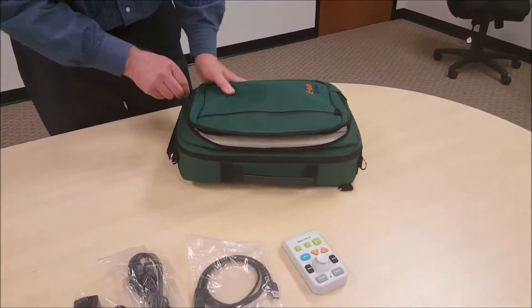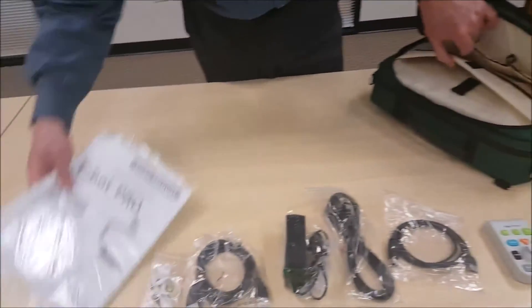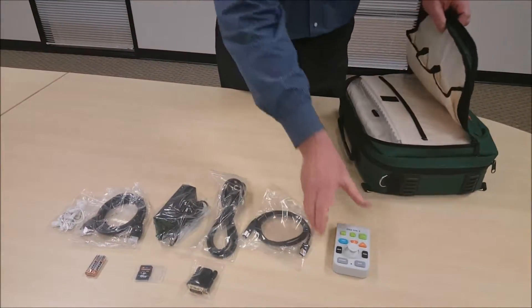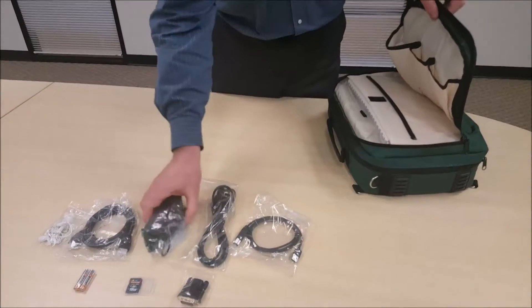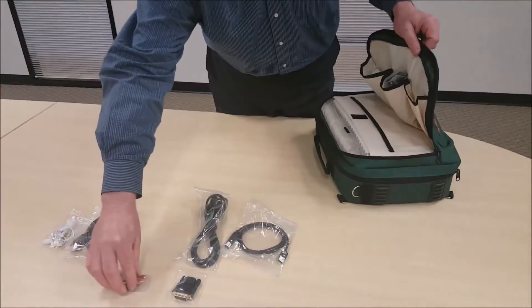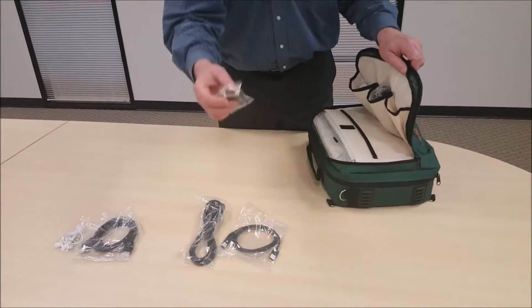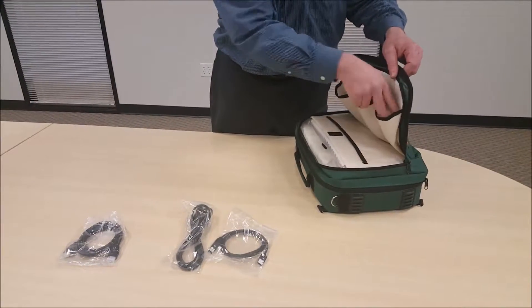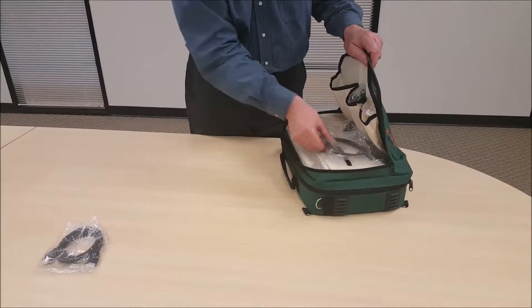Go to the other compartment to store all the accessories. The first thing to put in is the user manual, the CD, and the remote control into that slot. The power adapter goes into the next one. Then the battery, SD card, HDMI-DVI adapter, and earbuds go into the last slot, and the remaining cables can be laid in here.